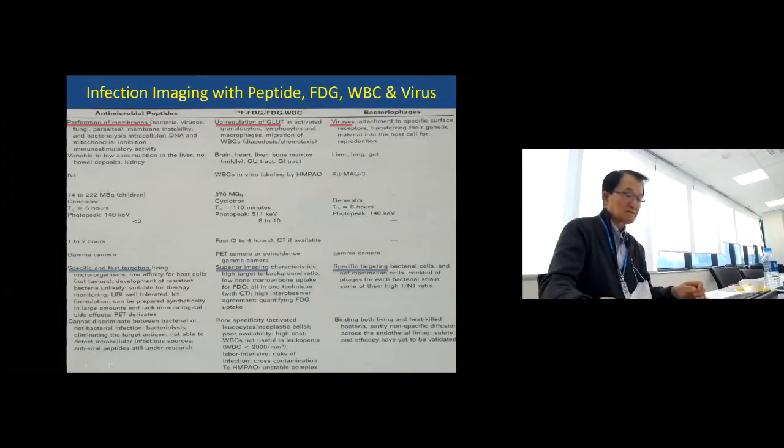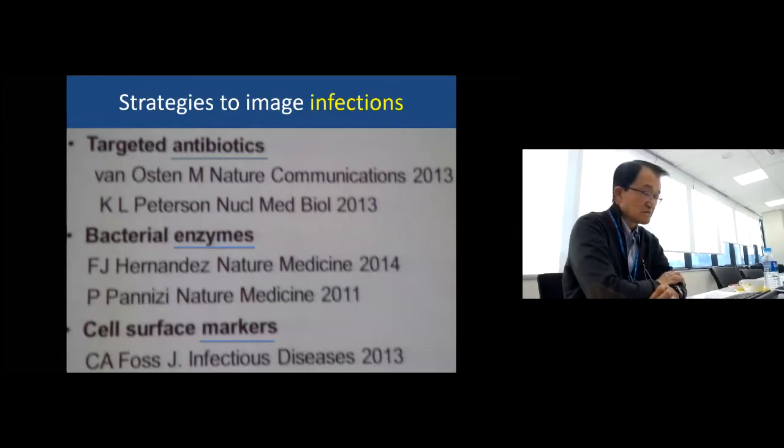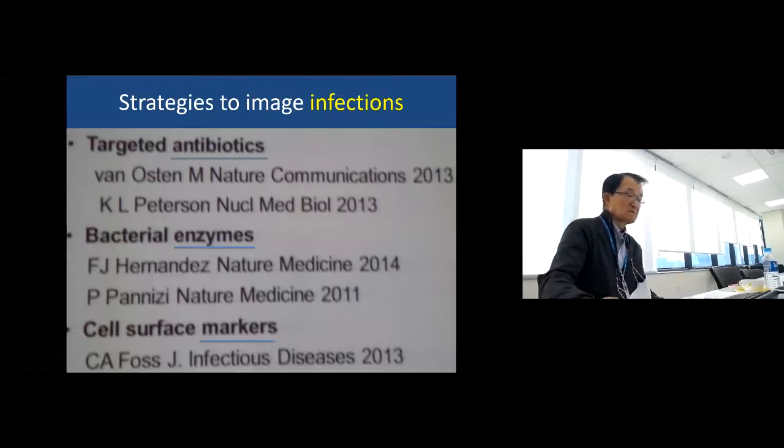Very specific targeting and superior imaging make a difference. In the old days, we didn't use a hybrid technique, so localization was a major problem. But now with SPECT-CT or SPECT-MRI, we can precisely locate the active inflammation, and by looking, we can estimate the burden of the inflammatory or infectious process.